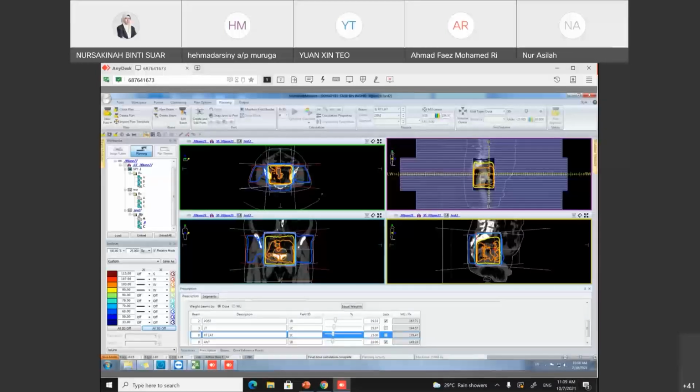After they change to 20, the result is not as good as just now, so I tell them to change back to the setting just now, but they do not know what they have changed. So you have to pay more focus and attention to this, whatever you play around with, else it will just waste your time.